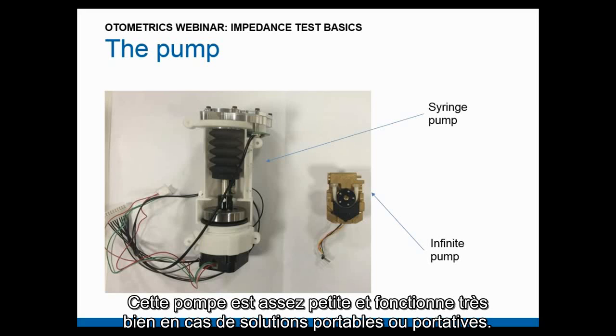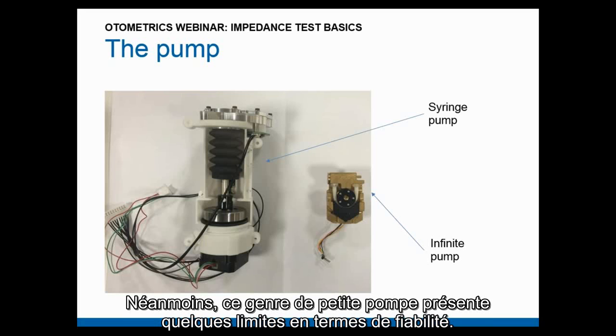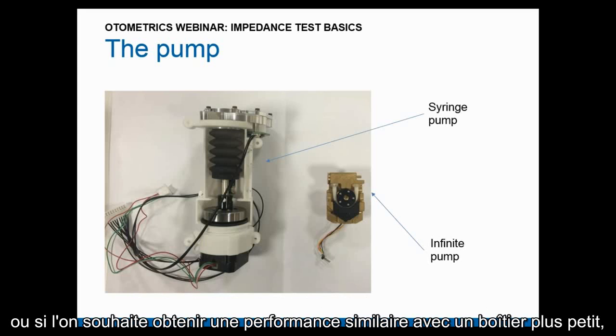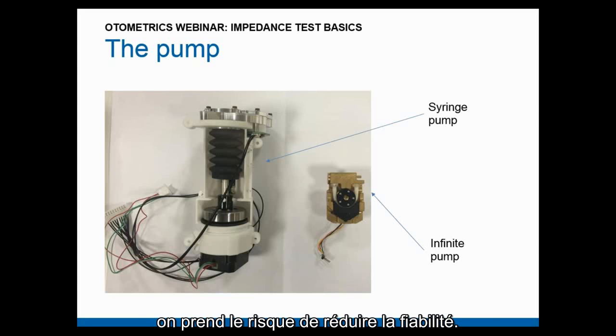And this small pump is quite tiny, and it works very well if you need a handheld or portable solution. On the other hand, having a small pump like this one can provide some limitation in terms of reliability, because as for any piece of technology, if you decrease the size of the components or you want to provide the same performance in a smaller housing, you have the risk to decrease the reliability.